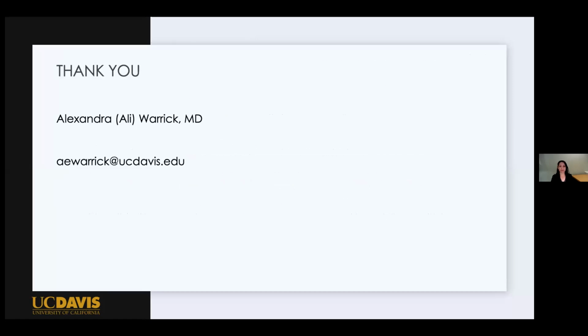All right, thanks, Allie. Great job. It's a complex area, at least in my opinion. The lateral knee, there's a lot of structures out in that area, and so your review of the anatomy out there was well done. And I think as folks are beginning to scan this region, or as they continue to scan this region, just knowing the anatomy is critical out here.